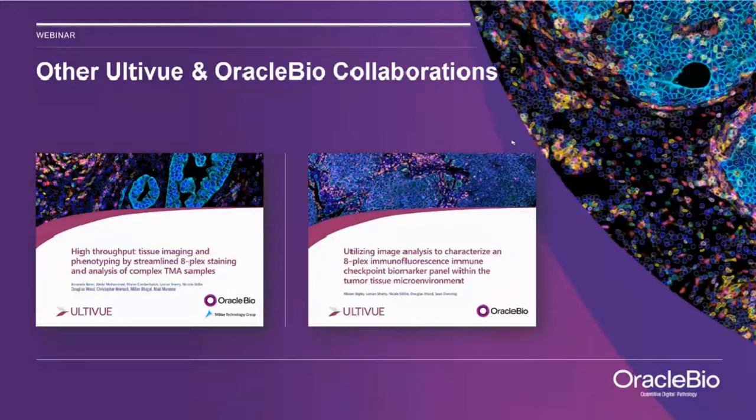Also Lorcan mentioned that most of the times this background staining, what we call autofluorescence, is coming into the FITC channel. We work with dyes and with an amplification method that really gives us a very high signal to noise ratio. So very rarely we experience problems like this. And in any case, even if you have some of the background staining coming up, you can still work with it on the image analysis side. So yes, we can work with hepatocellular carcinoma as well and get the analysis performed.